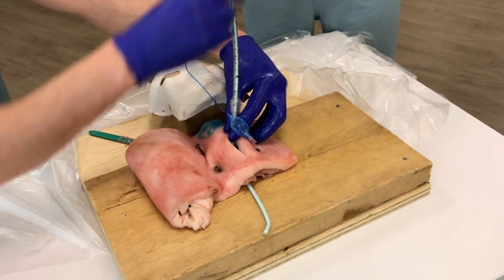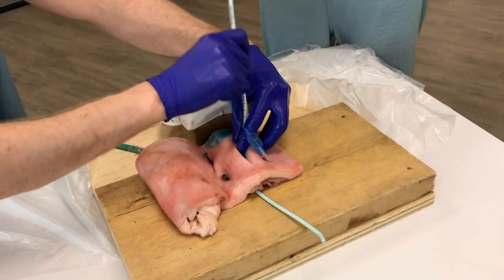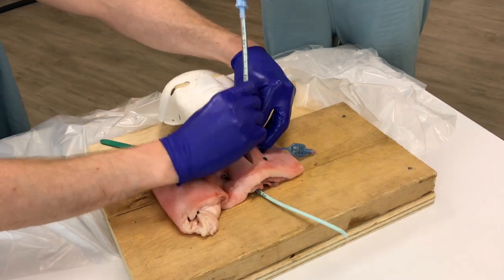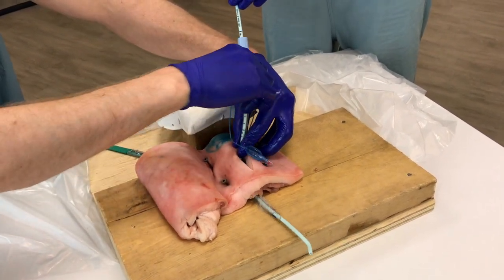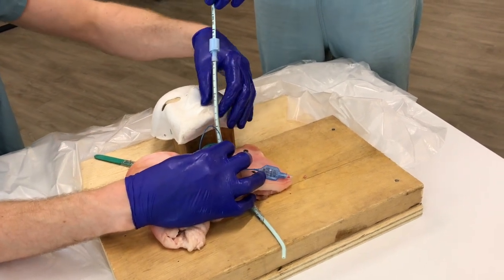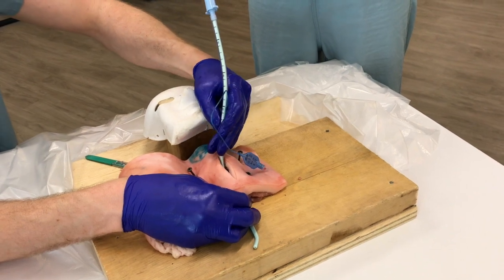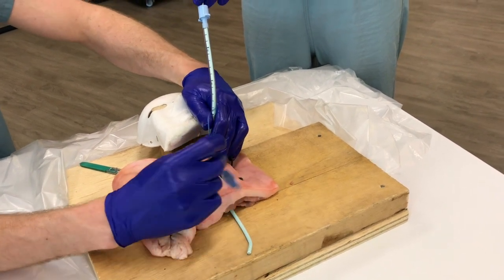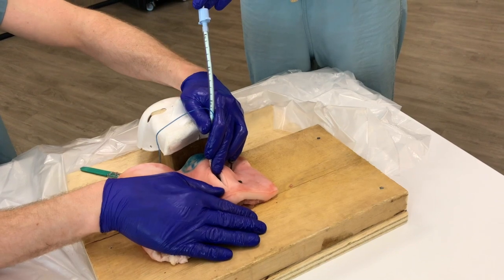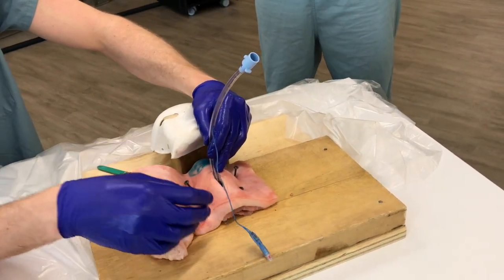Now when I pass the tube, I'm not going to push from up here. I don't have a lot of control. I'm going to push down close to where I'm at here. Osman's stabilizing the bougie, right? And I'm putting in the ETT. It's important not to go too deep here, obviously, right? If we're looking at where we'd be at the lips, 22 at the lips, we don't need to put this tube in very far. Okay, it's really just past the balloon. Cuff is up, we can remove the bougie, and we have successfully tracheally intubated our patient.